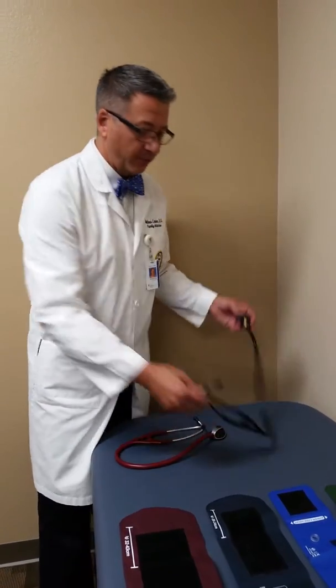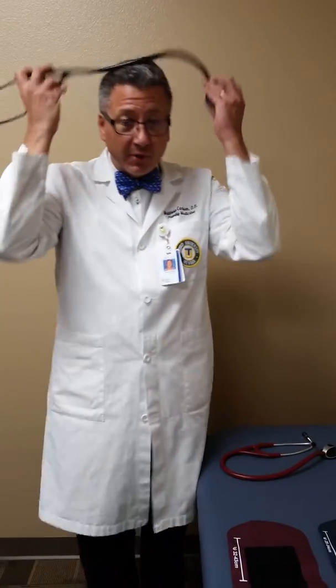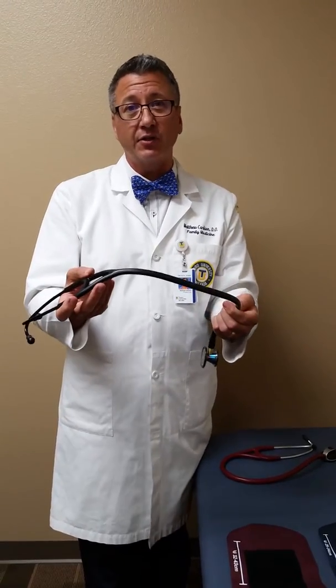When you wear your stethoscope, important things to remember: you can see that there's a turn to the earpieces, so when you put them on, you want those pointing towards your nose — they always go in a forward downward angle. I encourage people not to carry these around their neck, because exposure to oils will degrade your tubing, and it's also easy for an irate person to grab and garrote you with.